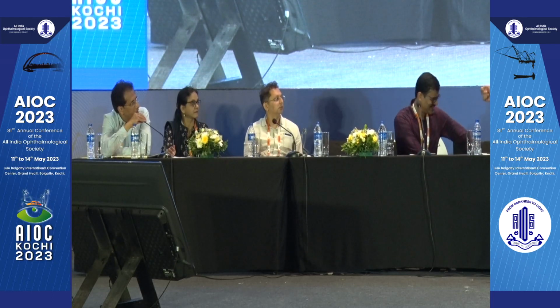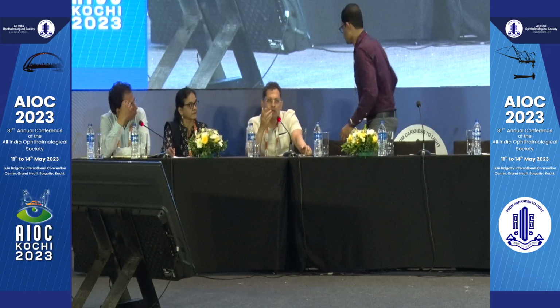Okay. So, Rishi, are you ready? Okay, fine. So the Barrett calculator and the toric planning devices, and those who have got IOL Master, what I would advise is that you make the toric IOL calculation before you counsel any patient. In fact, before you see the patient, so that you exactly know whether toric IOL is needed for that patient or not. Absolutely. I think the counseling should start only after all your examination is done.